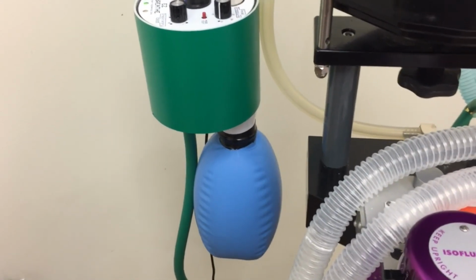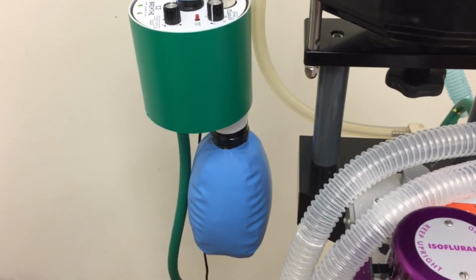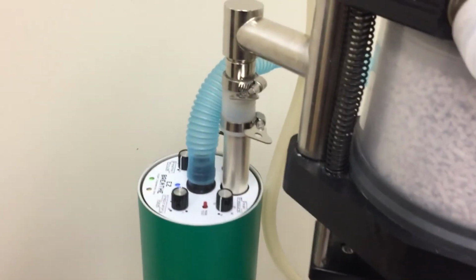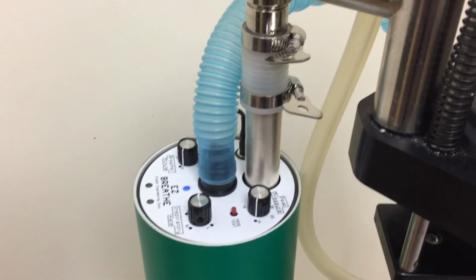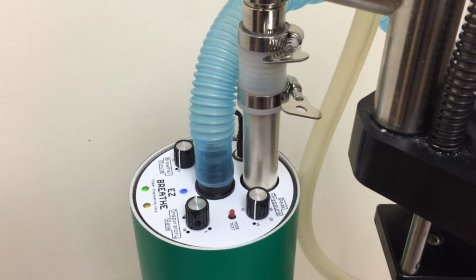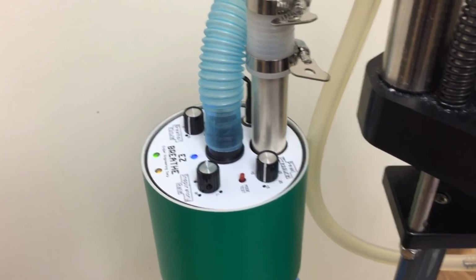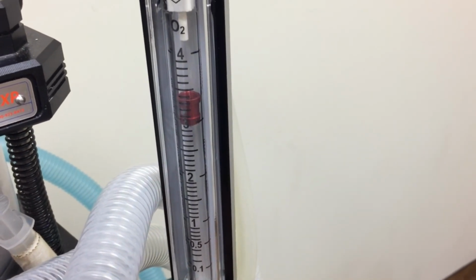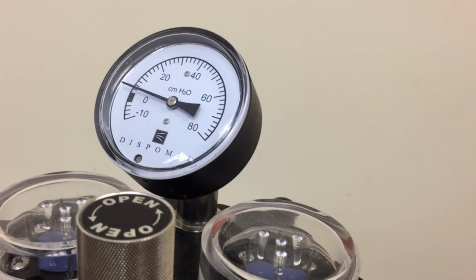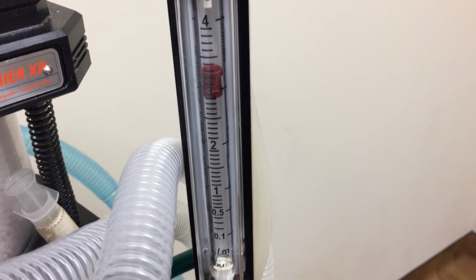Other things that can cause the low pressure alarm to sound are a very leaky cuff, or if you're using an active scavenger, sometimes the scavenger has too much vacuum, either because the filters haven't been cleaned or it just isn't set properly, and this will suck the gas out of the bag, making it very difficult to use the ventilator. In the short term, this can be corrected by turning the flow up to whatever is necessary to keep the bag inflated, but you should have your active scavenger tested and adjusted.